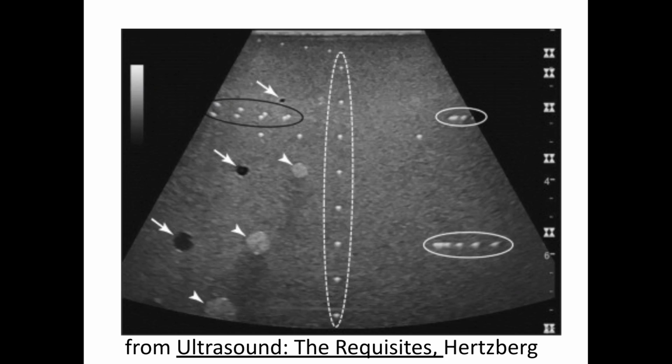So this is just an example of those 3 types of resolution using a model that they've created to standardize how an ultrasound is working. They know the depth of all of these BBs and how far apart they are from each other in different areas, and then when they take the image, they can go back to the drawing board and standardize this machine.